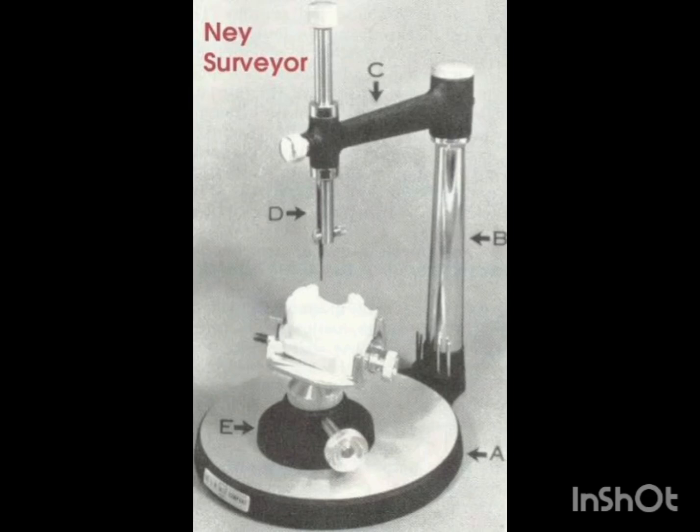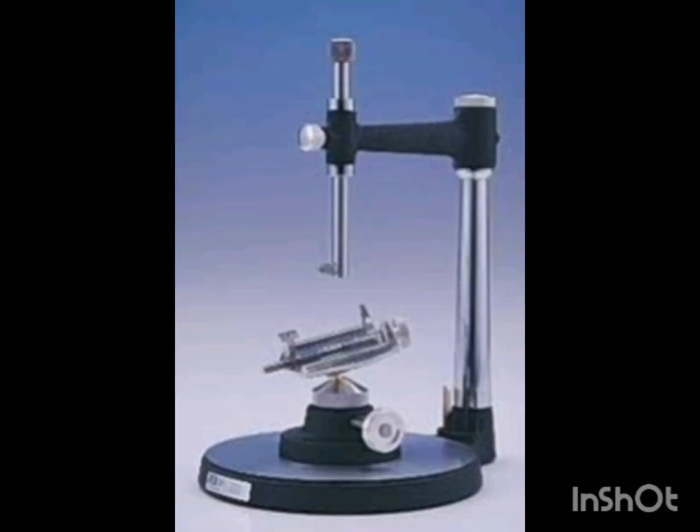Hello everyone. In today's session, we will discuss one of the most important instruments used in removable partial denture fabrication, that is the prosthodontic surveyor, also known as the dental surveyor. By the end of this video, you will understand what a surveyor is, what its functions are, and the clinical application.